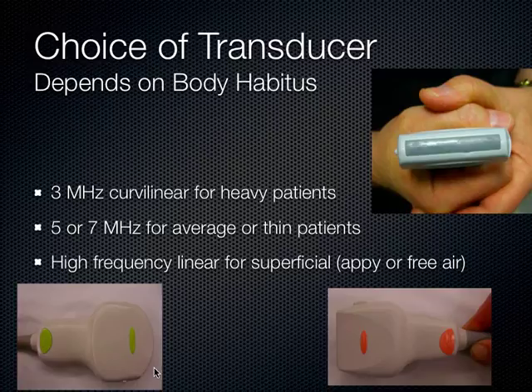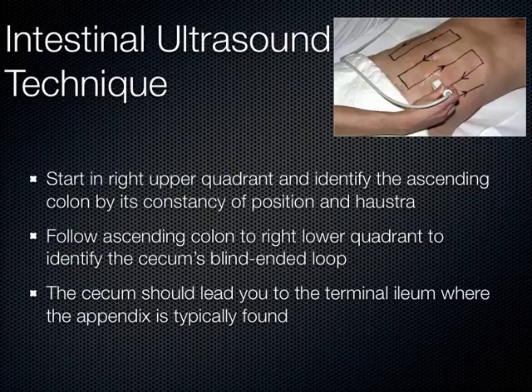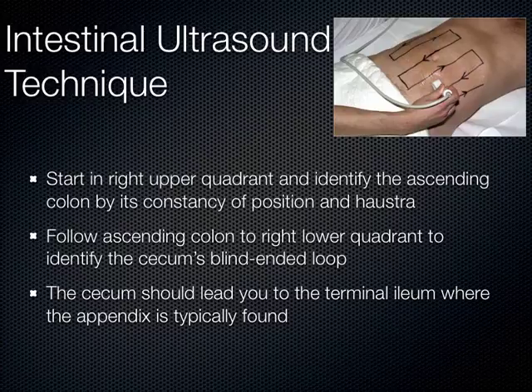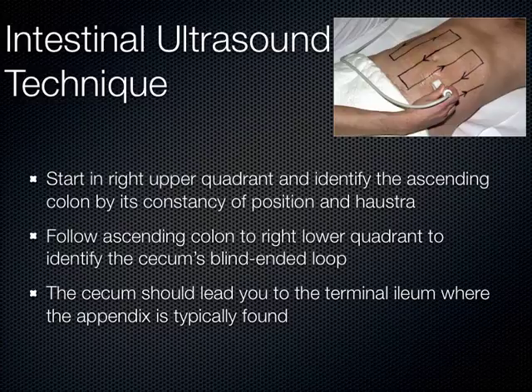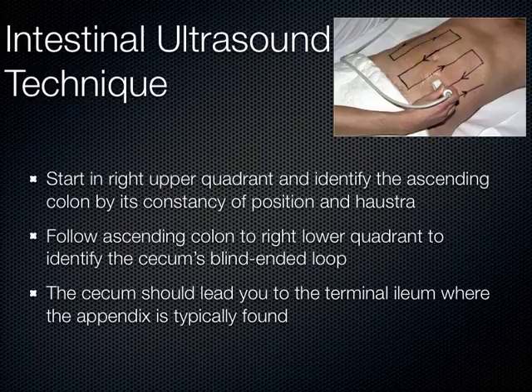We use a technique called mowing the lawn, where you start in the right upper quadrant. You can see the ascending colon there — it's always in the right upper quadrant and it's got haustra. You guys have had this in anatomy: haustra versus the plicae circularis that you see with the small bowel. You can identify those on ultrasound when filled with fluid. You follow the ascending colon down to the right lower quadrant, where you expect to see the cecum with its blind-ended loop, which brings you to the terminal ileum where the appendix juts off.